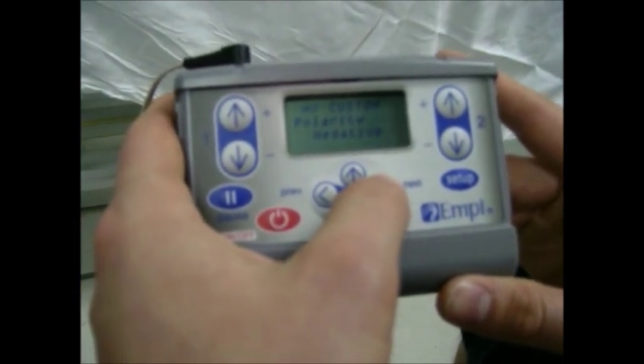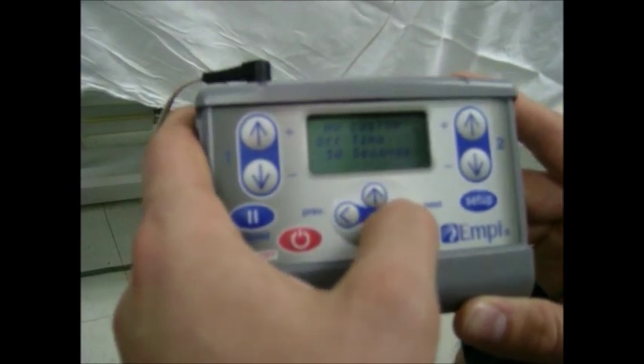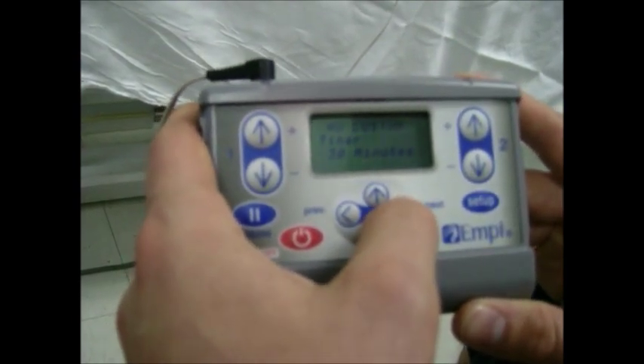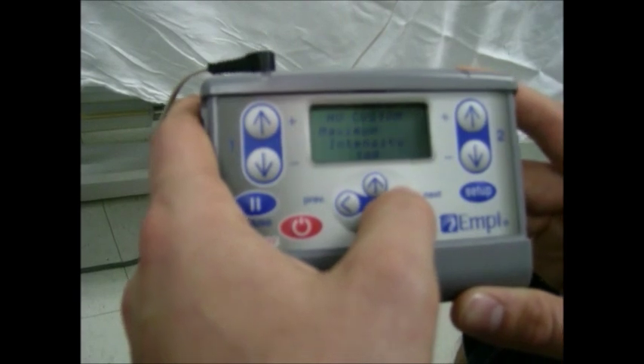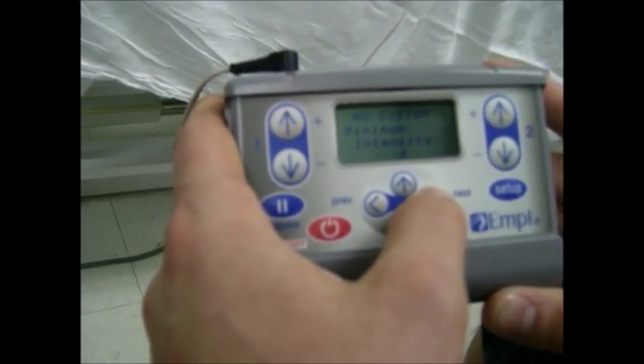We have a negative polarity, 50 pulses per second is our rate, our on time is 10 seconds, and off time is 50 seconds. We have a 30 minute timer with a maximum intensity of 300 and a minimum intensity of 0.